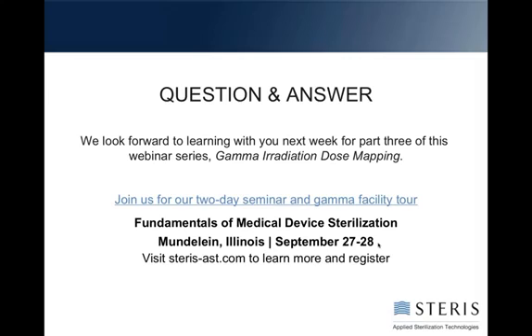You can use them, of course, they are your choice, but if you're validated to ISO, you are going to be expected to pass sterility at that verification dose. You would have in your procedures, if you had the BIs, my guess is your procedure would say that all the BIs have to be killed. So if you have that in your procedure and one was to survive, even if it was one that should not have logically survived, like the one on the outside of the box, but the one in the very center was killed, you are going to be faced with a dilemma. You are probably going to have to reject that product.